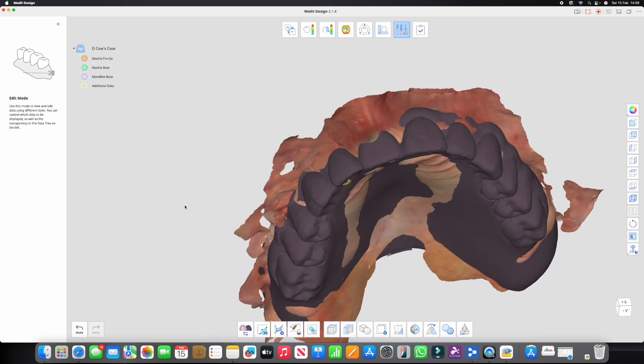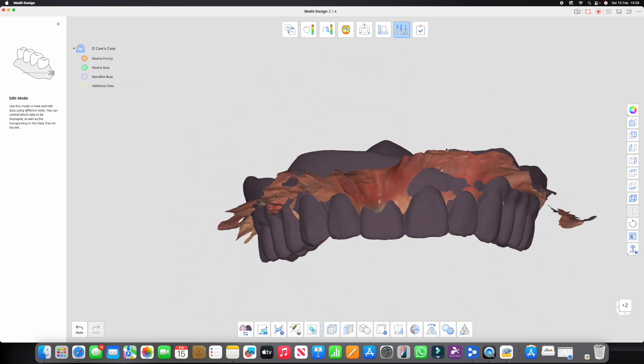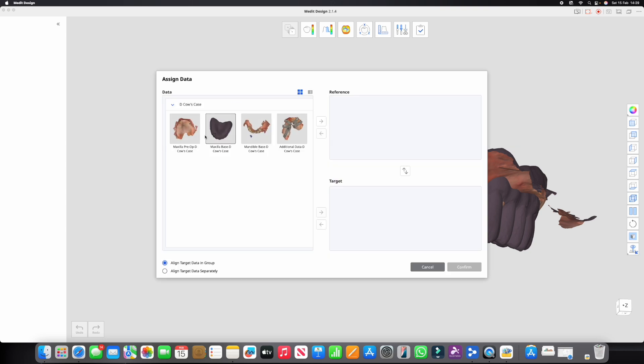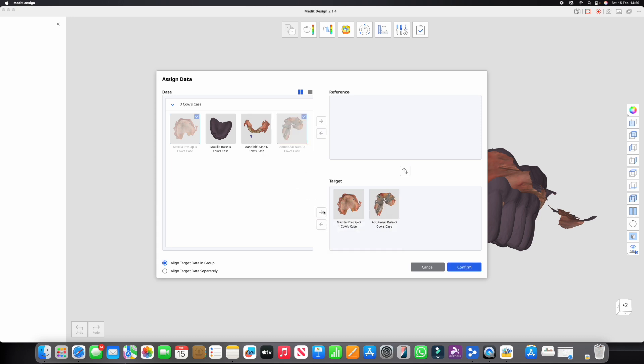So all we need to do is then go through into this little tool here, alignment mode. We're going to choose the target as those two scans because they're aligned, they can both go in here and they're going to move in the same way. We're going to choose this denture base as the reference that's going to stay static.